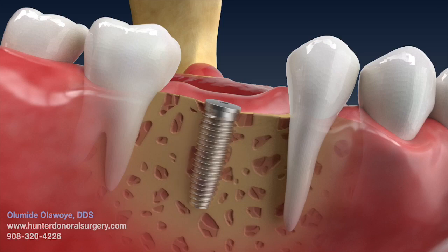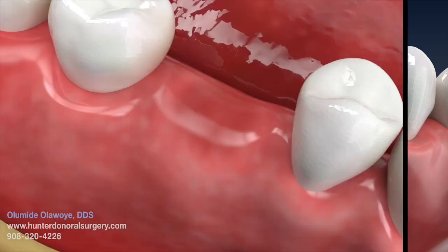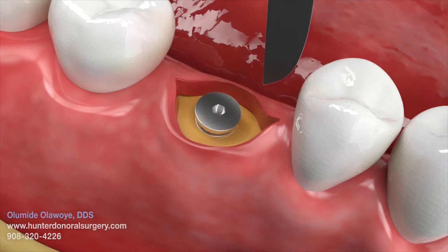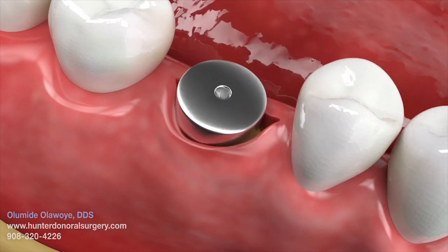After allowing enough time to ensure bone grows around the implant and the stability is verified, an appointment will be made with your dentist to begin the restorative process — in other words, to place the tooth crown. This may be anywhere from four to six months.